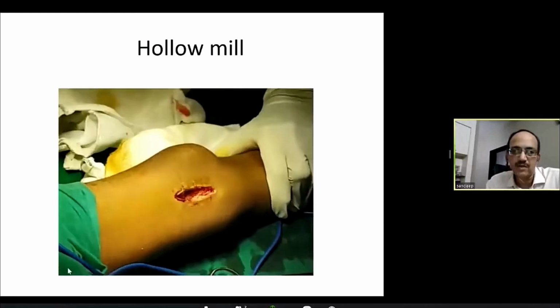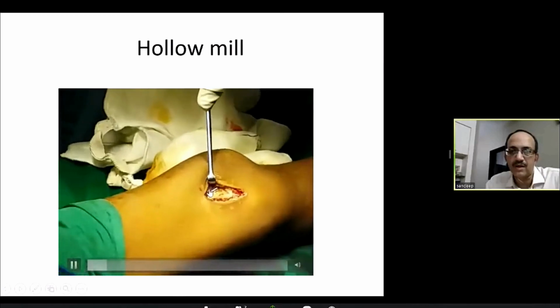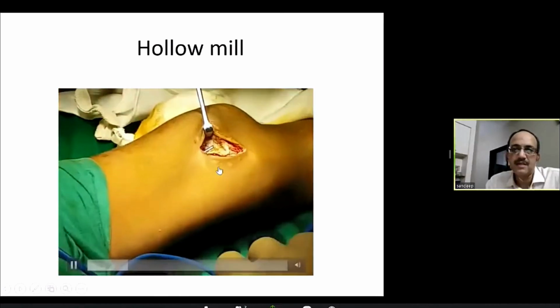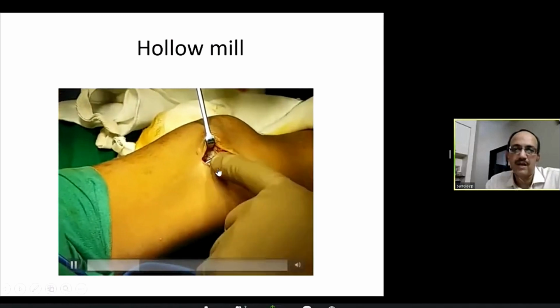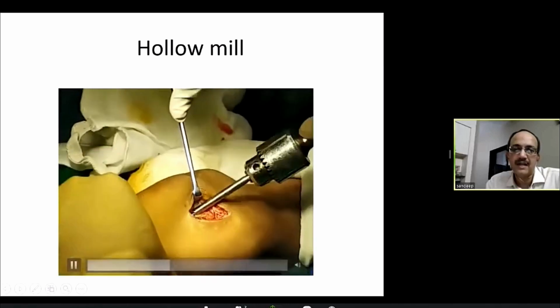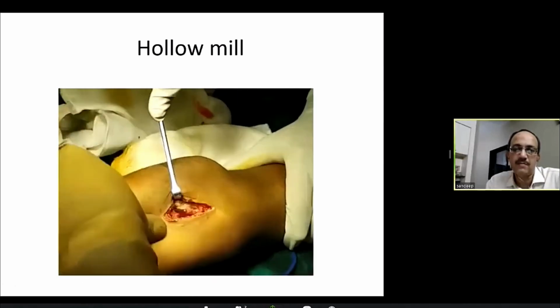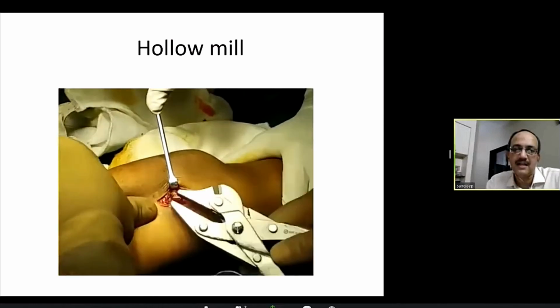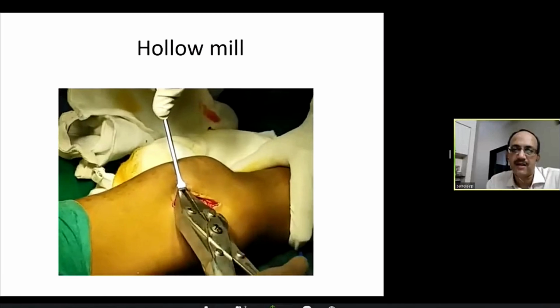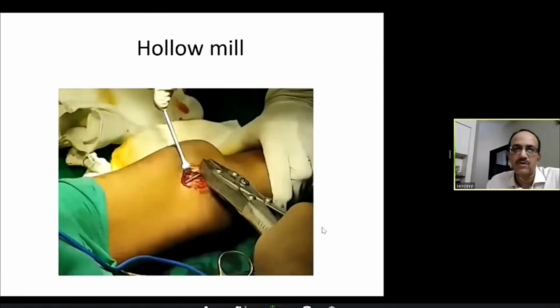I'll run this again for you. The nail, 1 centimeter, is usually left outside flush with the cortex. You can see that here. After exposing it, just pass a small hollow mill around that against the cortex, and turn it 90 degrees. You will be able to do that. And then you will be able to hold it with a plier at 90 degrees and then backhammer it. Sometimes holding it with the tip becomes very, very difficult and it keeps on slipping. So this is a small tip that you can do.